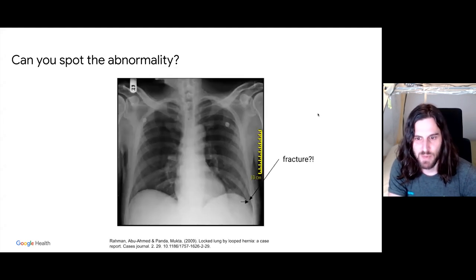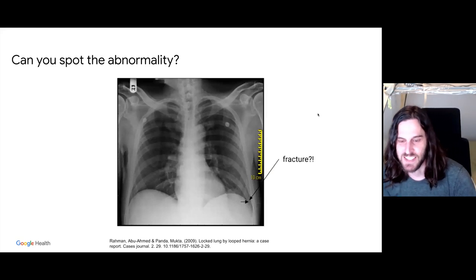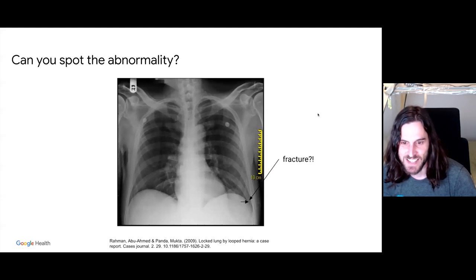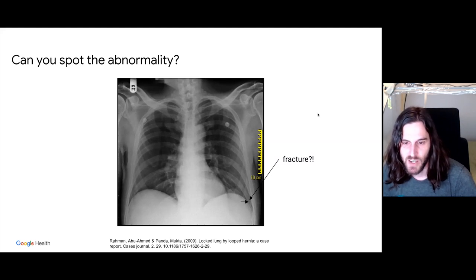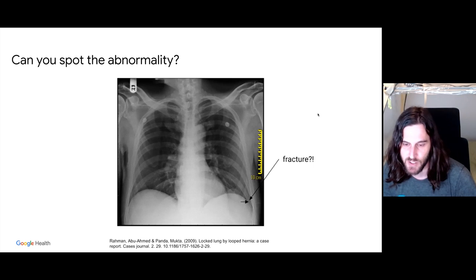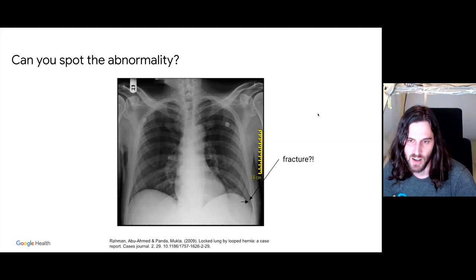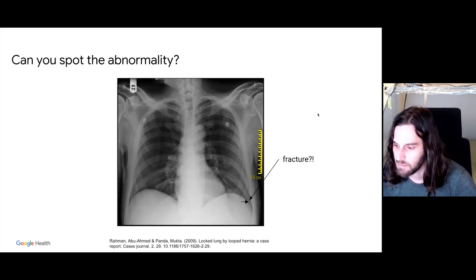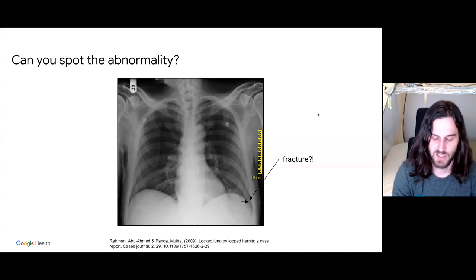This last example — there's a rib fracture down in the bottom right of the screen, on their left. This is the type of thing that can very easily be missed, and it's also very hard for AI to pick up on. It exemplifies some of the challenges we face here.